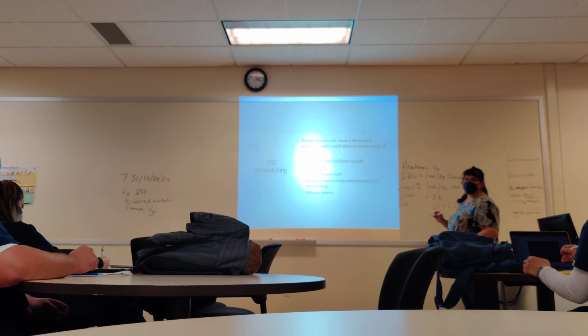It seems kind of redundant, but what you actually need to do is convert. If you get kilos, you have to convert it to pounds. So if you're intubated, let's say he weighed 65 kilos. ANT is anatomic dead space, by the way. So that's him intubated. If he's not, he's 65 kilos times 2.2. It almost doubles it, but it's going to be a little bit more: 143. So 65 mLs of dead space tubed, 143 mLs of dead space not. So it's a pretty big difference. Yeah, anatomic dead space.